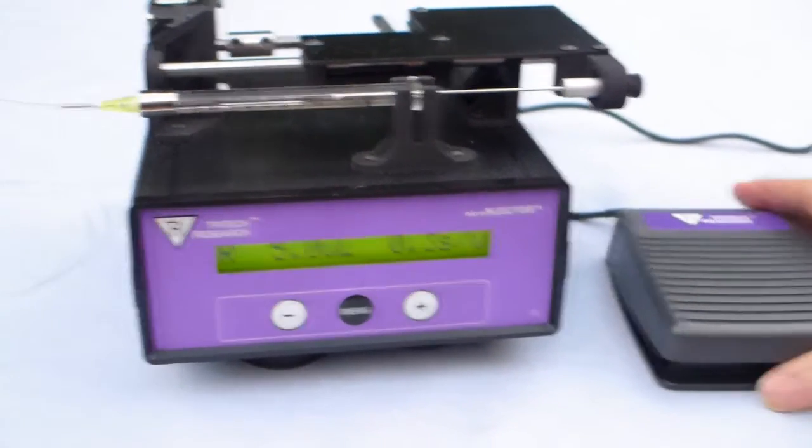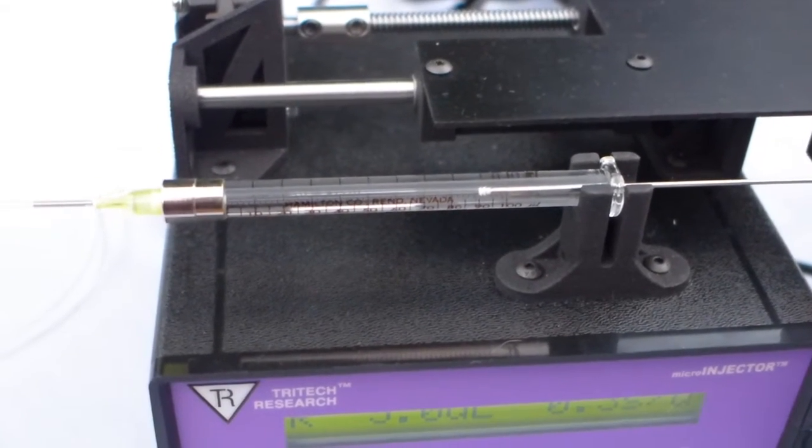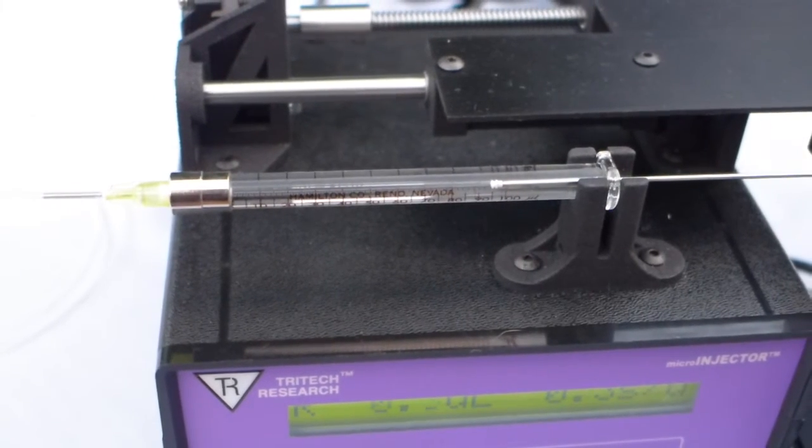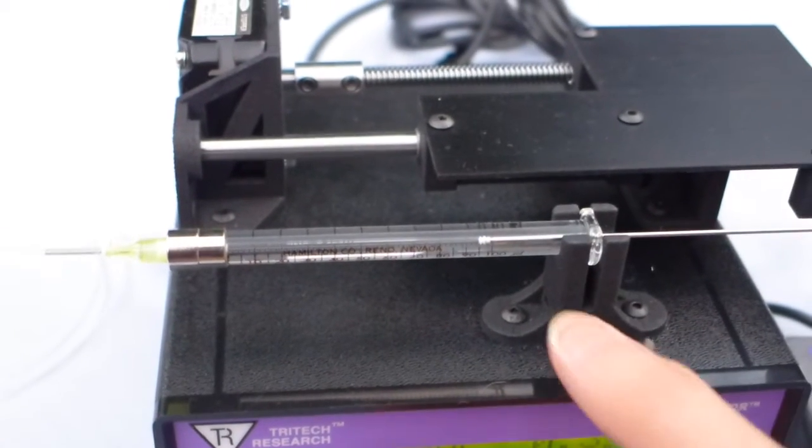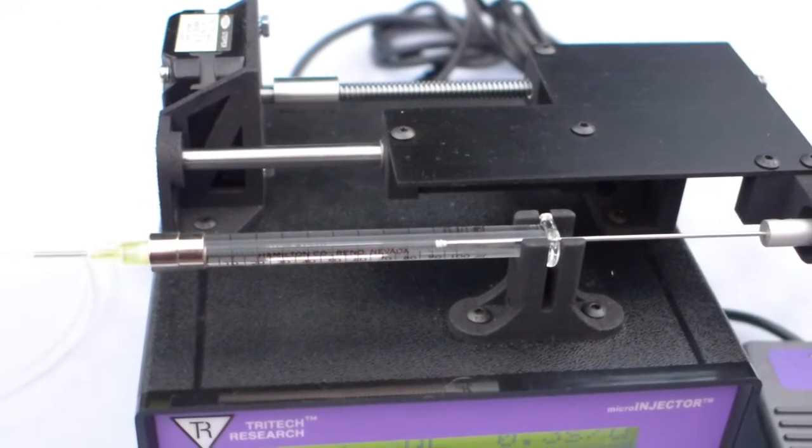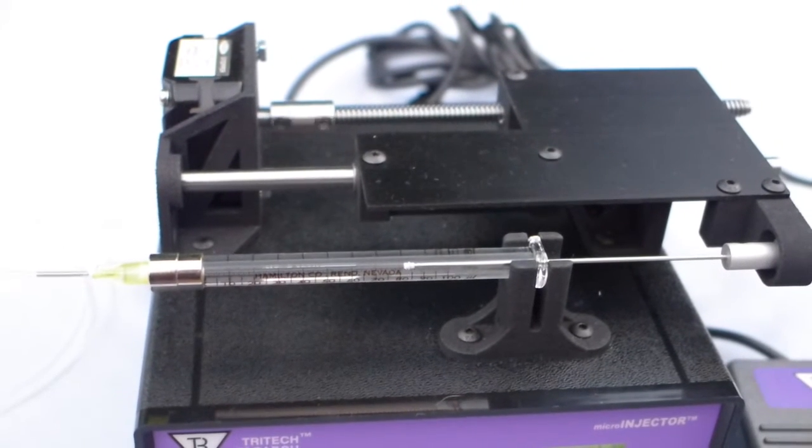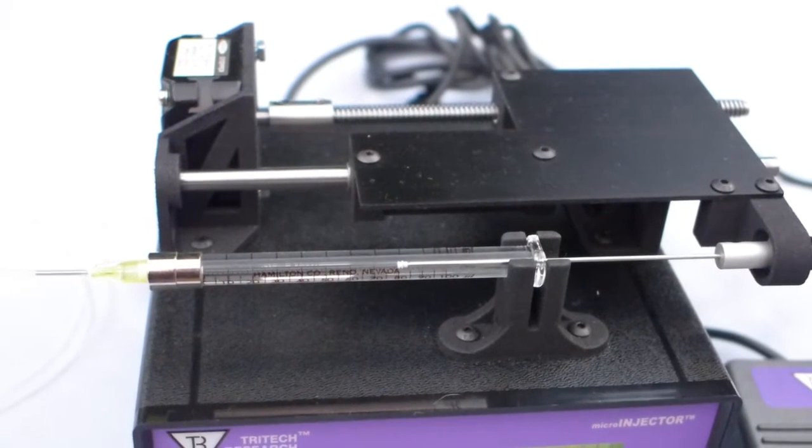It's controlled by a foot pedal. I'll push the foot pedal, and you can see the plunger in the syringe. That was reversing. Now I'll go forward. And each time I hit the foot pedal, it advances 5 microliters.